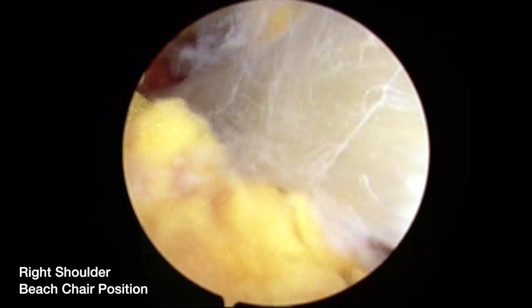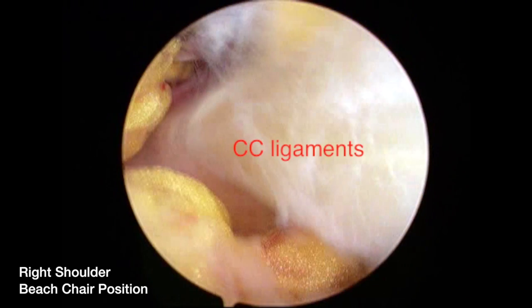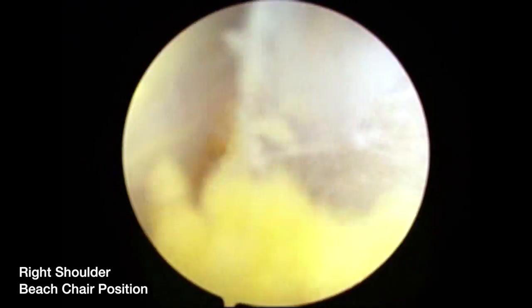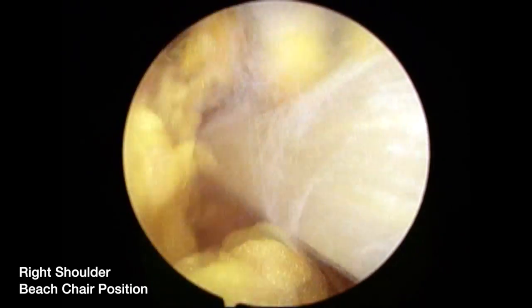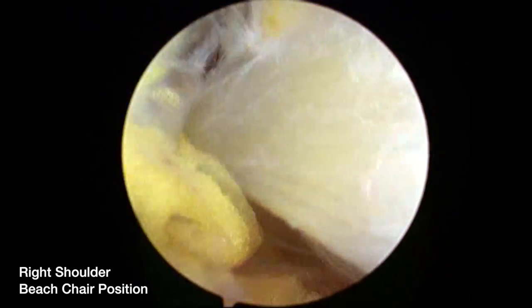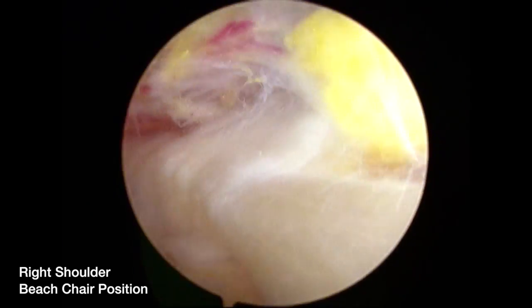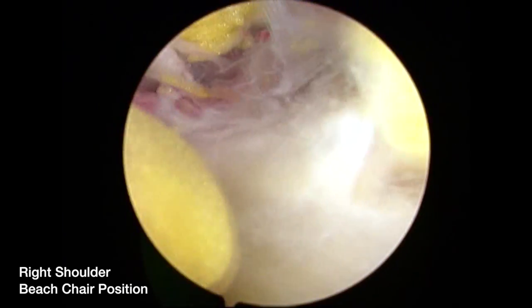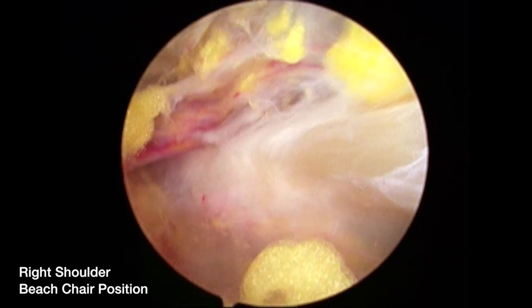The trocar is again placed in the anterolateral portal. The base of the coracoid and the conoid ligament are identified. The trocar is then in the suprascapular nerve portal, aiding in visualization of the base of the coracoid. We continue to use the trocar in the suprascapular nerve portal to sweep and visualize the base of the coracoid. This will then lead us to the transverse scapular ligament. The trocar continues to sweep, and the suprascapular artery is beginning to come into visualization. There is the transverse scapular ligament, with the artery running above it.